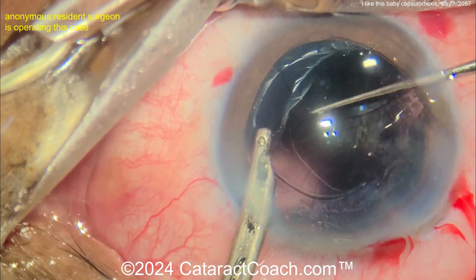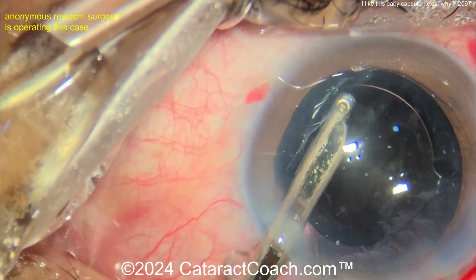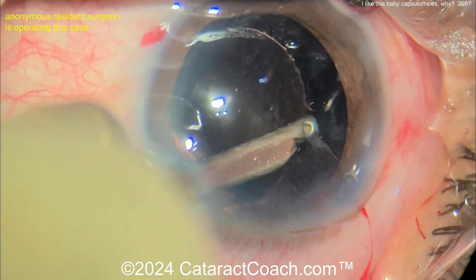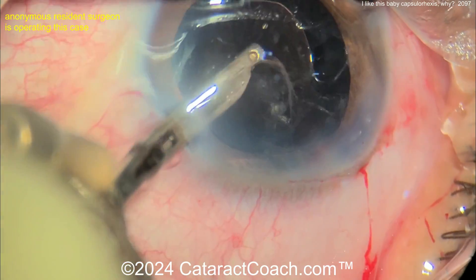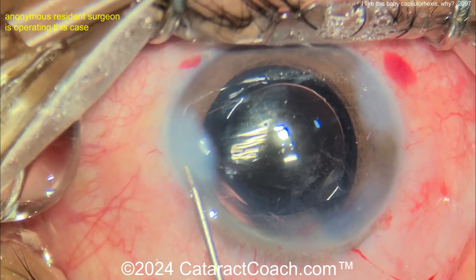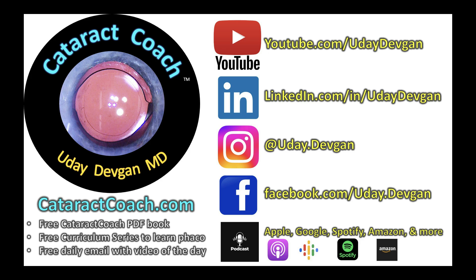There you go — went in the bag pretty nicely. Make sure the other half looks good. A little bit of cortex remaining — get all that out. The patient's going to be pretty happy. So yeah, I don't like a baby rhexis — except if you're doing the double rhexis technique for an intumescent white cataract. Then of course the first rhexis is going to be a baby rhexis. That's the whole idea. Beautiful case — thank you for sharing.